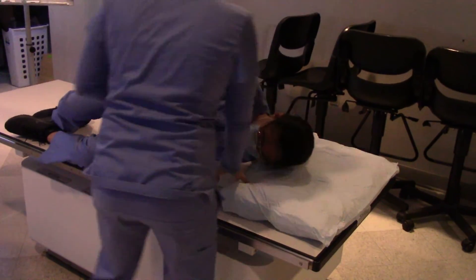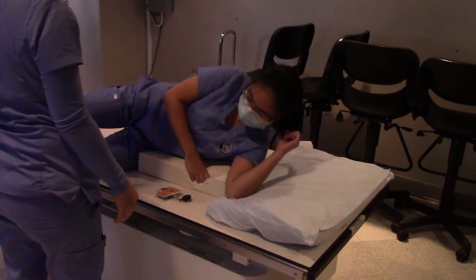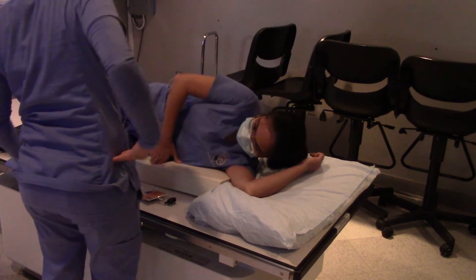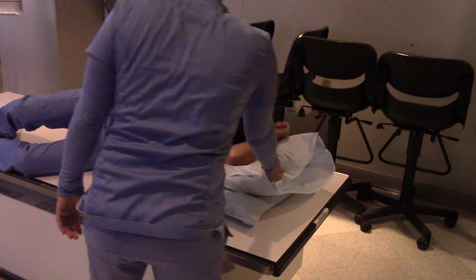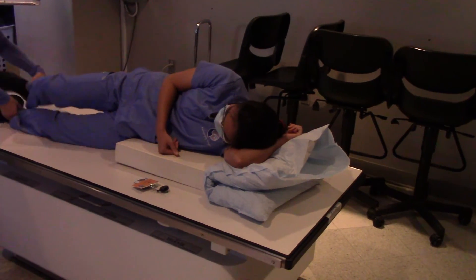We've got a very cooperative patient today laying on our sponge. You can move it if you can, but if it's right, you're good. You see how doubling up your pillow really helps for patient care — and then if you can free your legs.